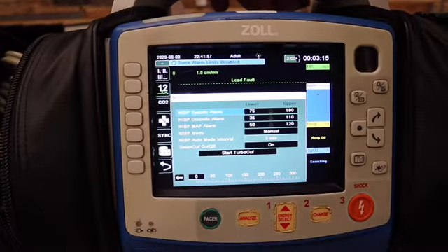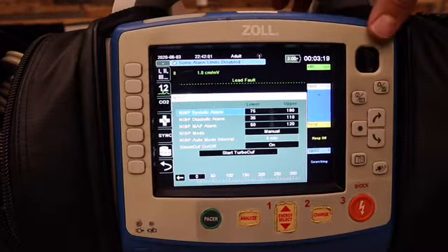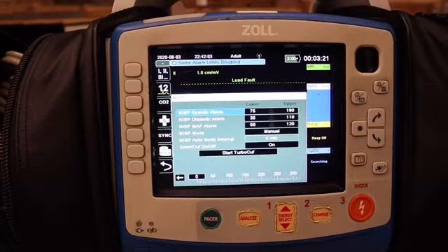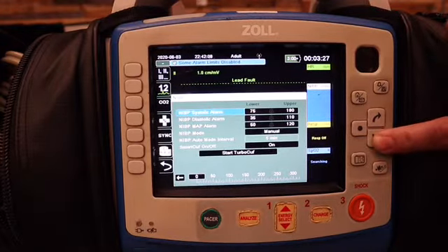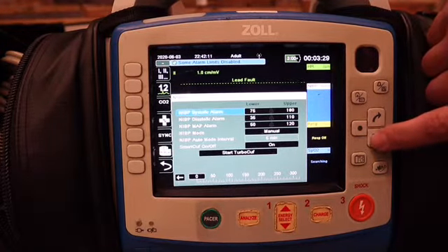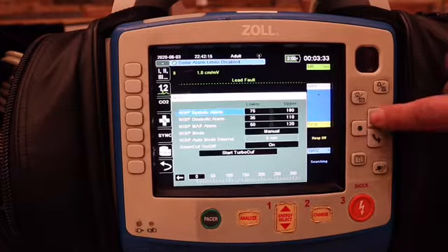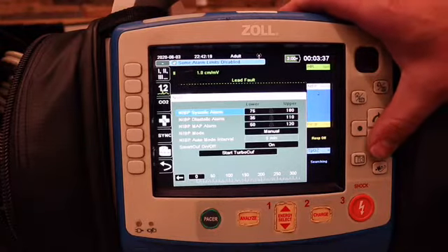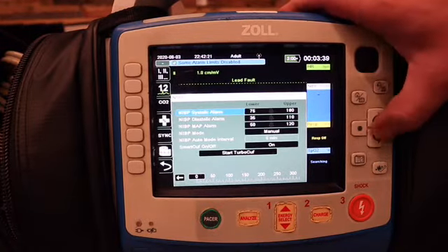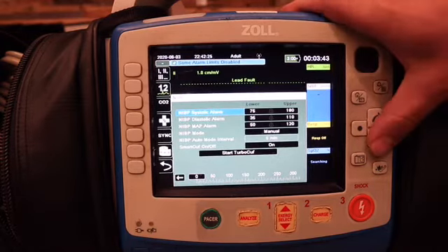Our screen is going to show us all these different values — all these different ranges of tolerances where an alarm is going to sound or not. These are defaulted and set up by admin. We do have the ability to change them if we want to — say if we're doing a lengthy transport, we can change it so that it's not alerting every time even on a borderline reading.